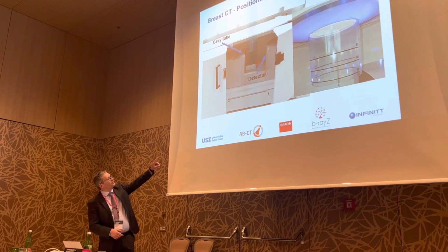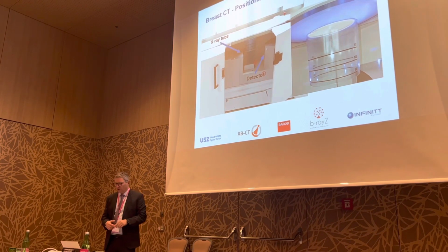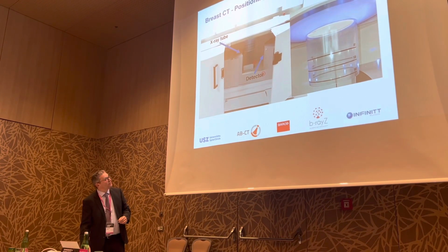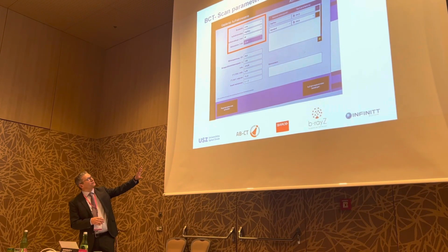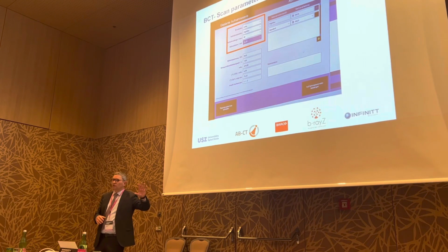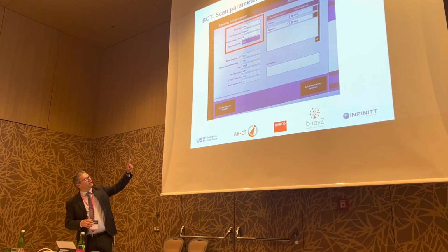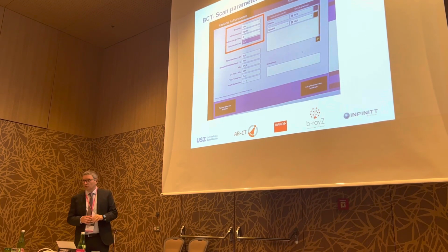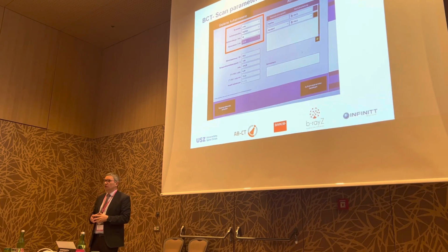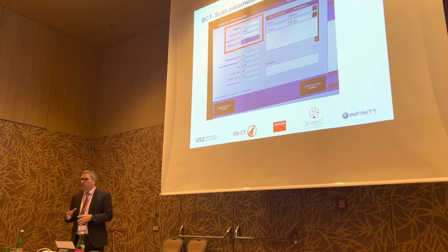Again, you see the detector, which is the most important part and also the most expensive part of the CT scan. Here is what the technician has to fill in. Basically, there are only two relevant parameters which you can fill in. The one is the length of the breast, as we said, and the other one is the tube current. So the tube current is not automatically adjusted, but you choose the tube current before the examination.